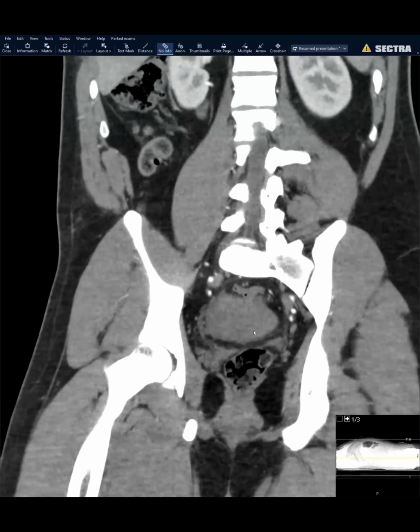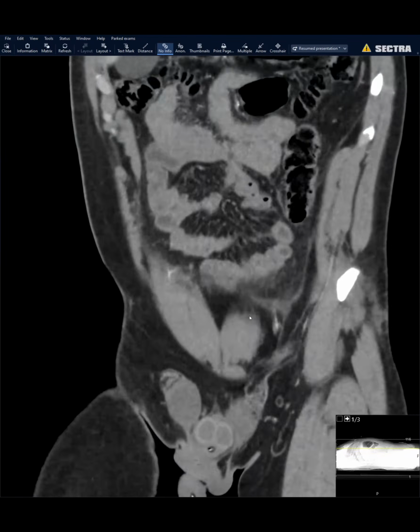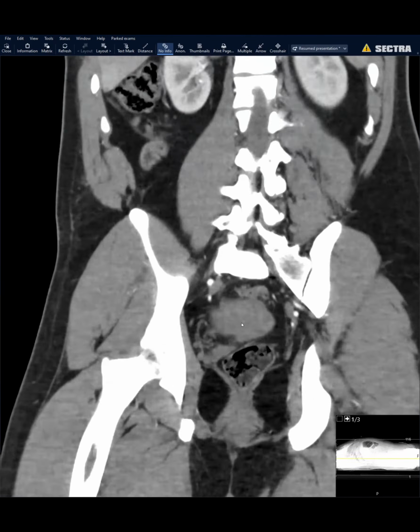You use dual plane, right? Coronal and axial. We use triple plane, we use coronal, axial, sagittal and whatever other plane that they choose to give us at that point of time. Yeah. Absolutely. Yes.